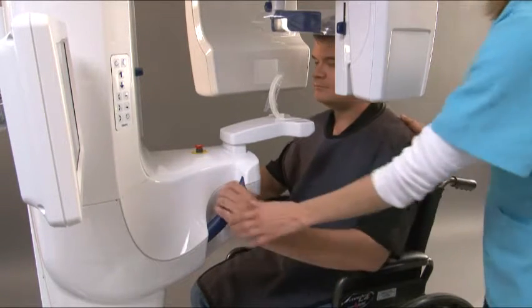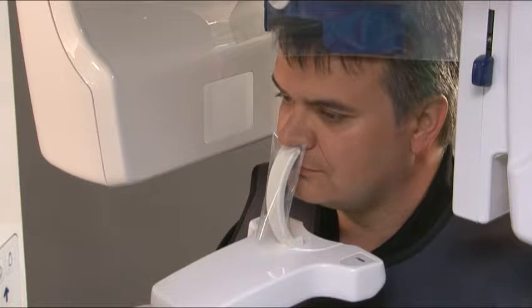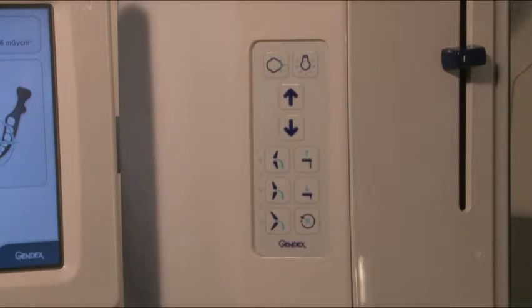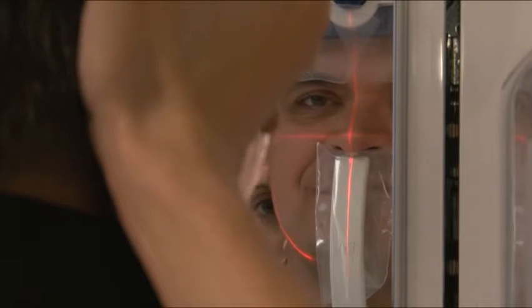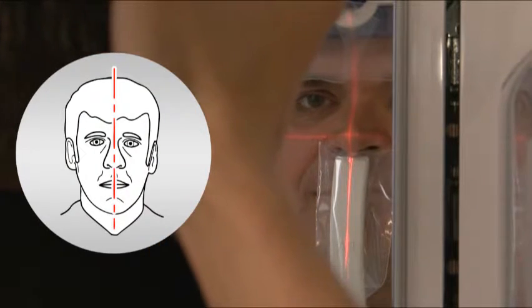Help the patient approach the unit. Ask the patient to grab hold of the handles and press their top lip against the top of the nose support. Press the laser button to initiate the laser alignment lights. For mid-sagittal placement, verify that the patient's head is not tilted or turned to one side.